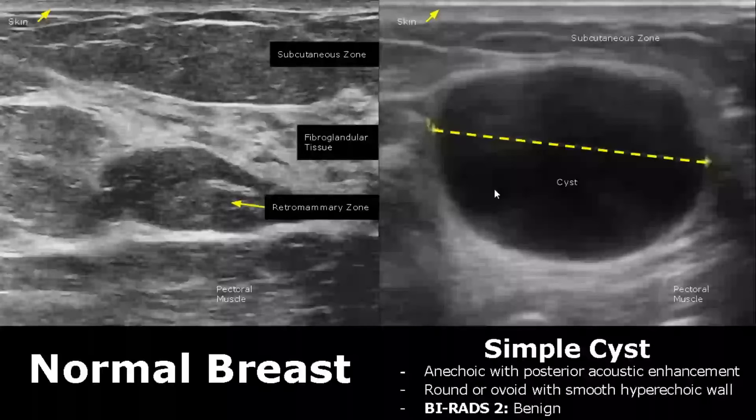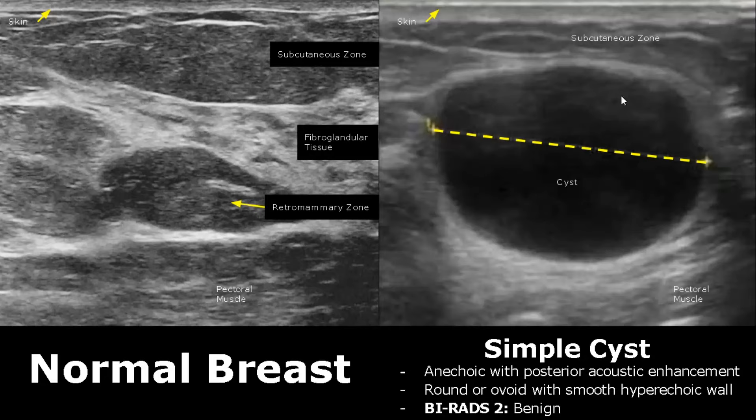A simple cyst will appear as an anechoic structure with posterior enhancement. The cyst will be round or ovoid with a smooth hyperechoic border. It is classified as BI-RADS 2, which is benign.